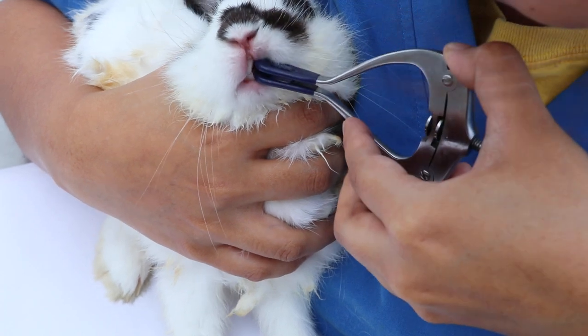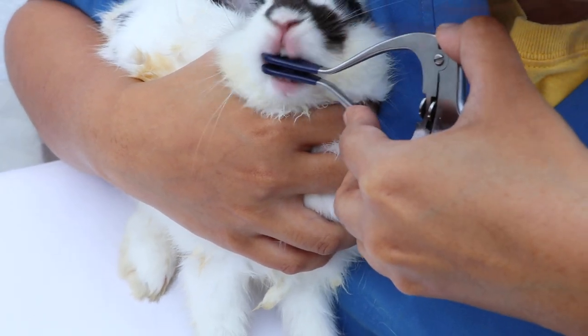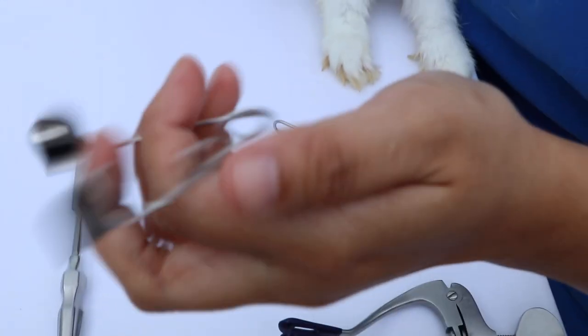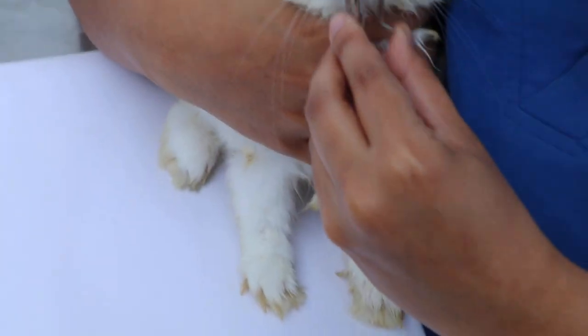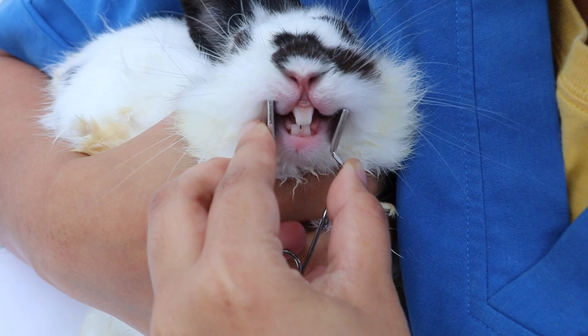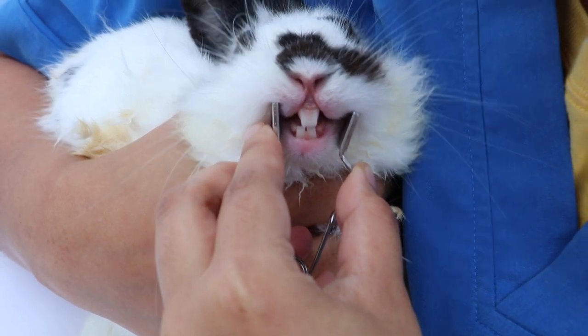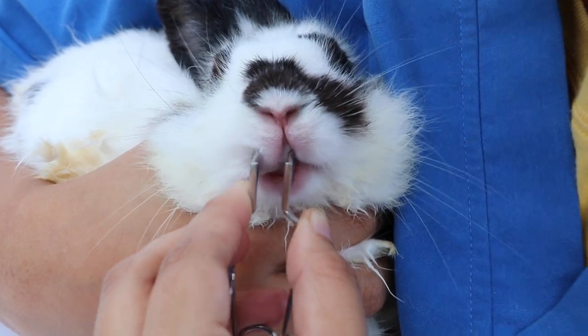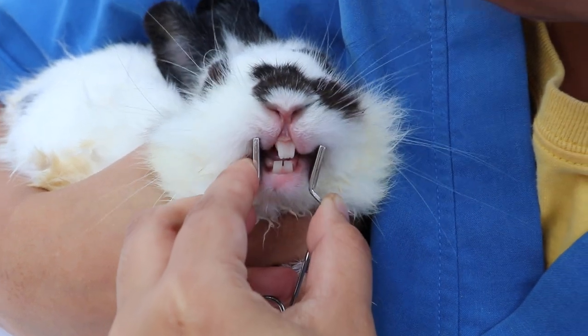The second one is also a mouth gag, used the same way to open the upper mouth and inserted in the incisor. The next one is the cheek dilator — this is the small size — used to widen the mouth so that you can see the molars clearly and perform treatment under sedation.